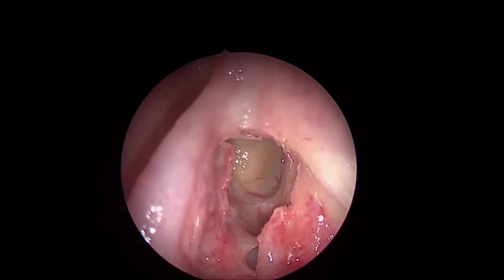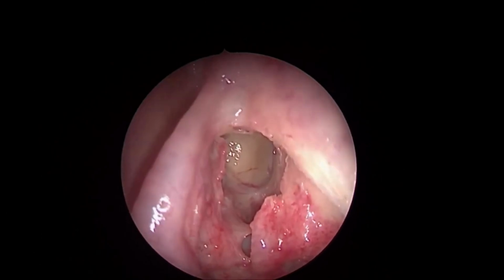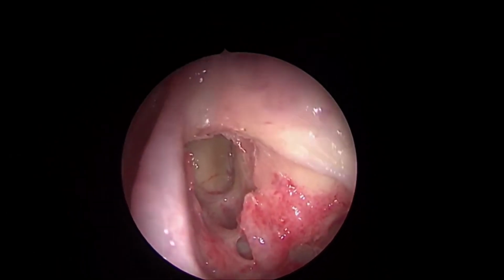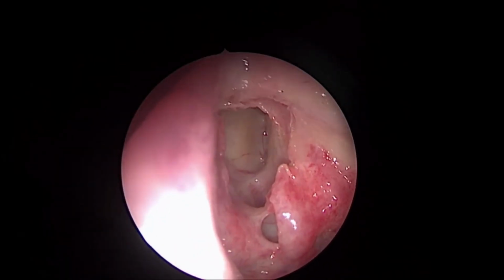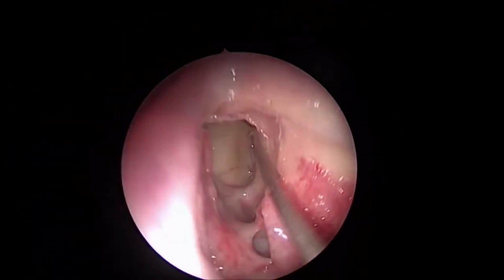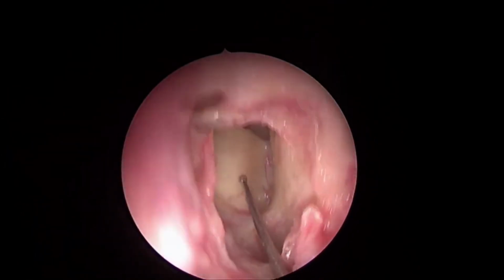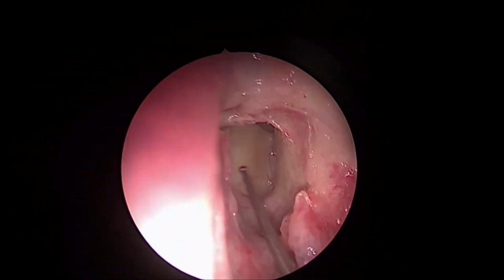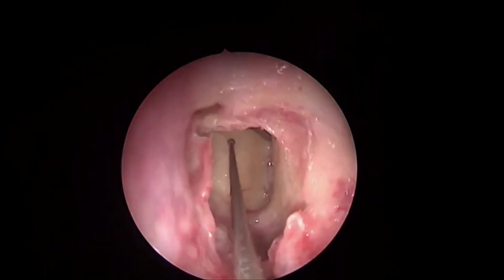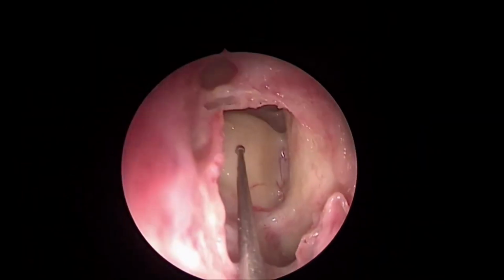The reason is the direction is away from the skull base. Now imagine there are cells on the posterior wall. Where in the posterior wall? Let me show you. This was the cell here anterior to it. Had I been having cells over here on the posterior table, I would not afford to go behind it and fracture it out anteriorly. Otherwise, I would end up entering the skull base.